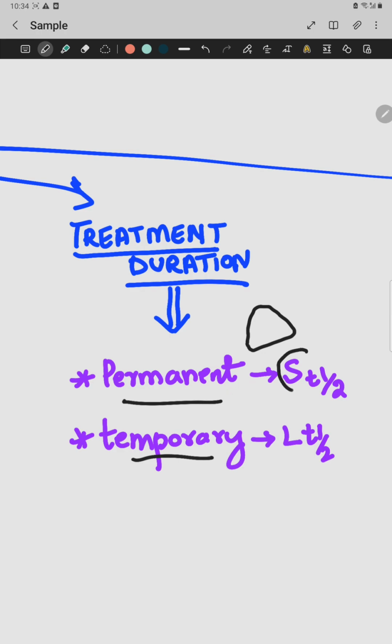Permanent is where there is a shorter half-life radionuclide, and it stays for the whole lifetime of the radionuclide, usually until the completion of the radioactive decay, and the patient is sent home after a while, after keeping the permanent radionuclide.